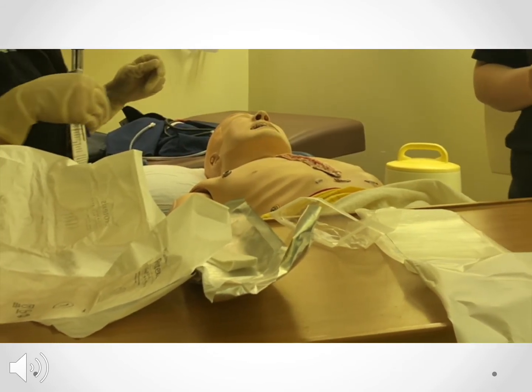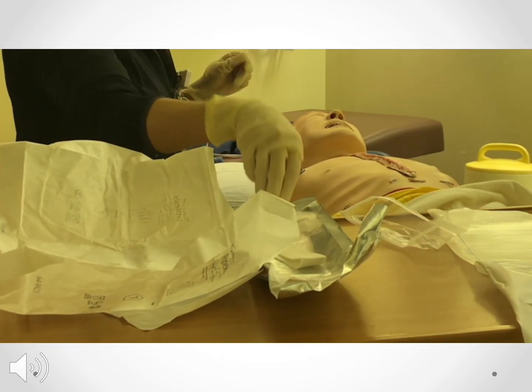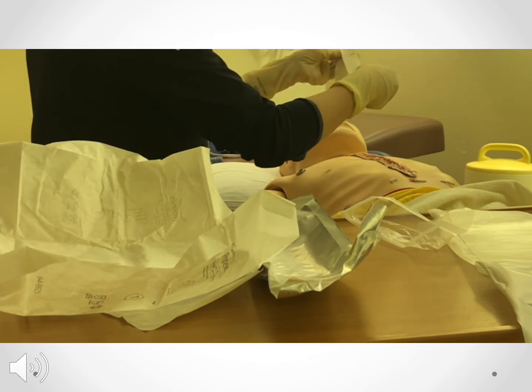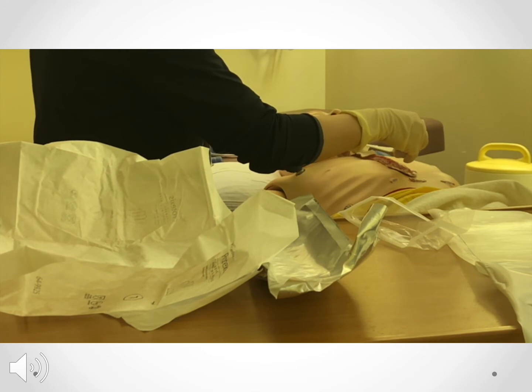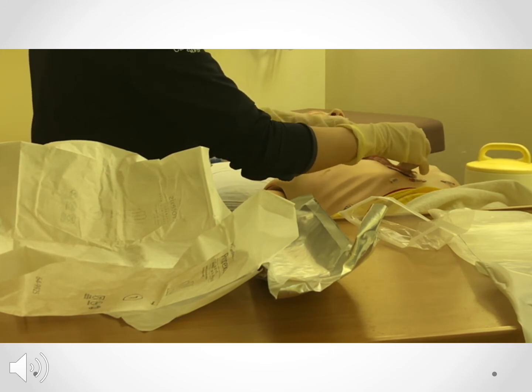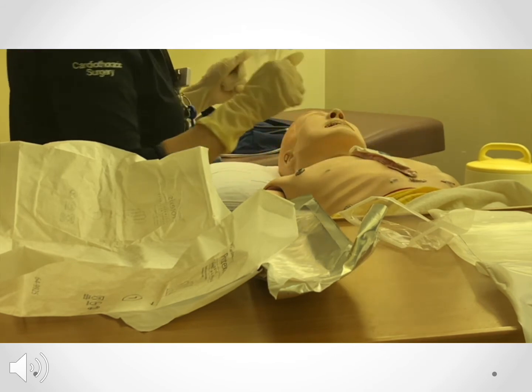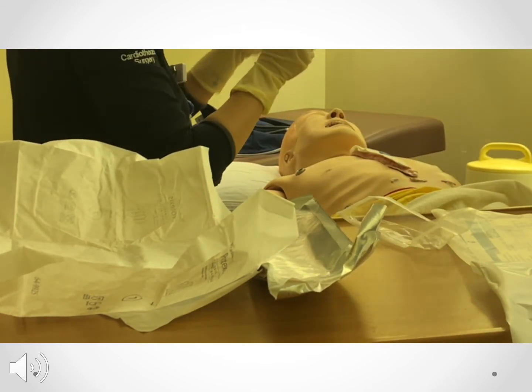She will now place the alginate dressing down the sternal wound. And now placing the transparent adhesive dressing over the top.